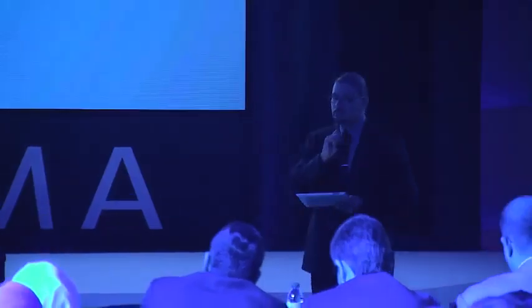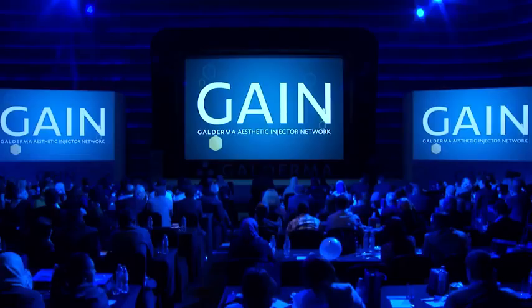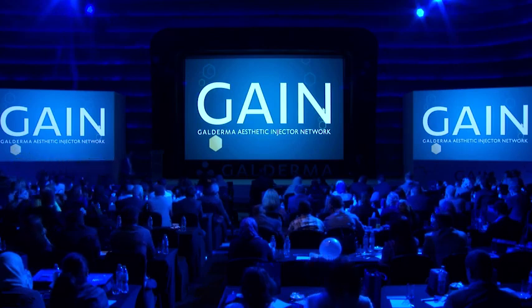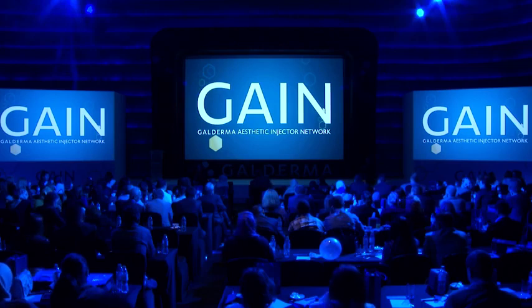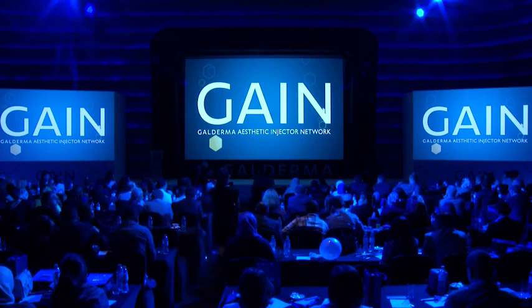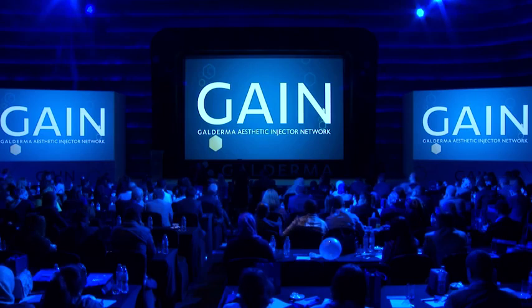Okay. All right, I do have a very, very important question here. I think it's worthwhile addressing. I have a question saying if when you're using skin boosters, can you use a cannula for the sake of bruising? And if not, why? That's a very good question, to be honest. I like a lot the use of skin boosters with cannula, okay? If it's a case like the older lady that has just left, I might go for the injection technique with the clicker, because also we will have a little bit of effect creating collagen due to the number of injection points.